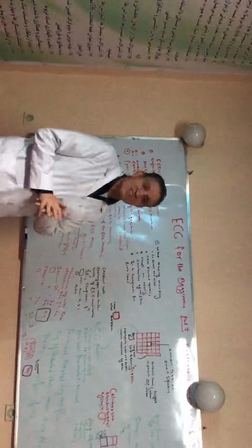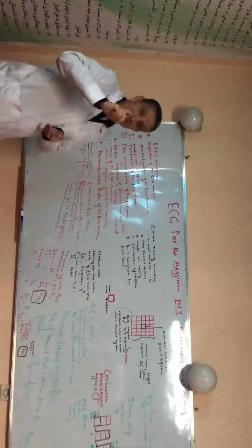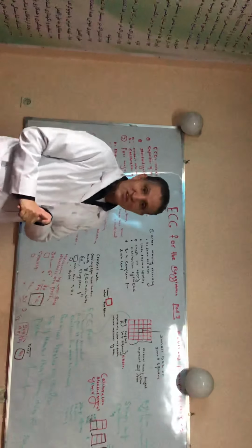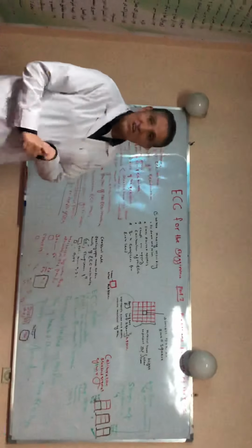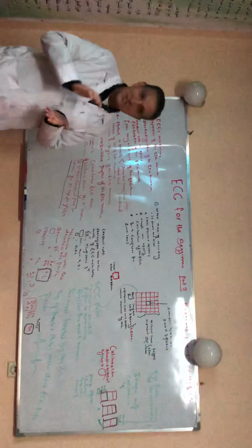What does it mean, constant rate or constant speed? It means 300 large squares of ECG paper move under the stylus or needle of the ECG machine within 60 seconds or 1 minute. So 60 seconds is equal to 300 large squares, or vice versa.